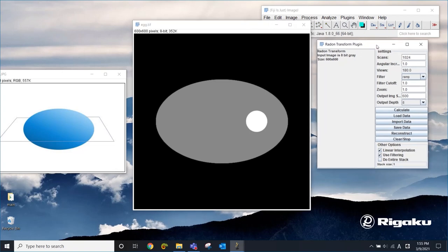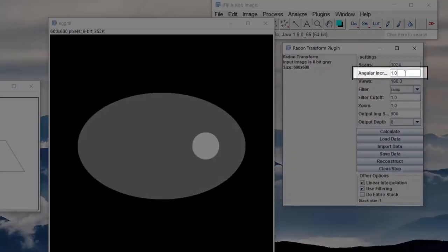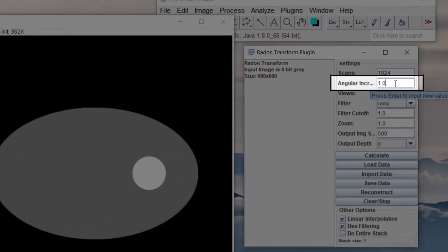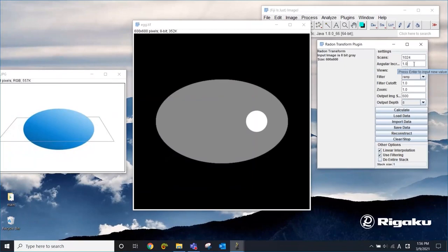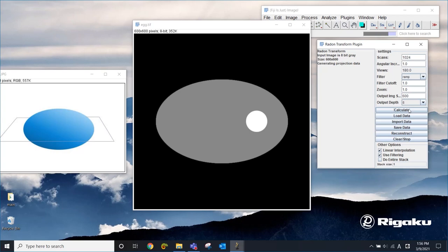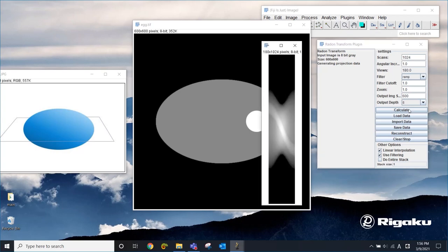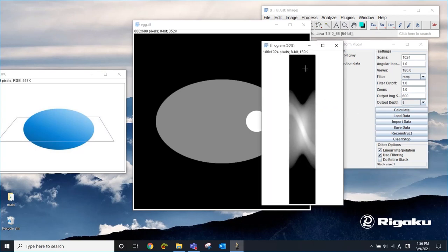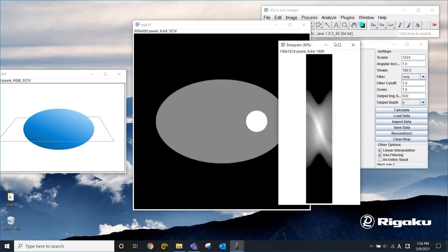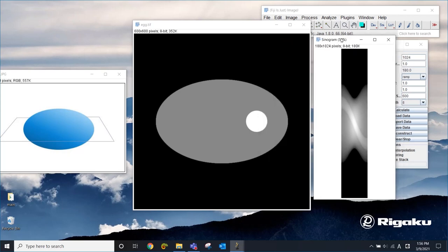There are many parameters but we're going to just look at this one, the angular increment. You can see this as the step size of the CT scan. I'm going to leave this as one for now and click calculate and it's going to calculate a set of projections from zero to 180 degrees. So we have 180 projections here. This is what sometimes people call a sinogram.